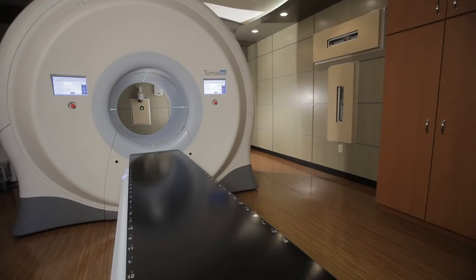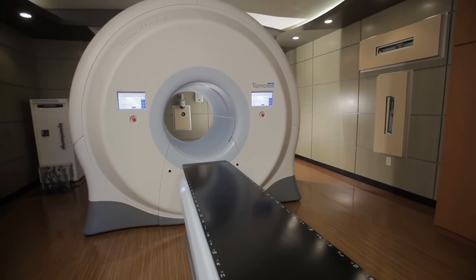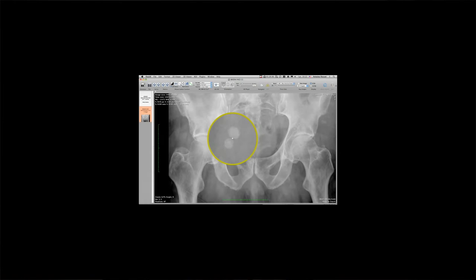One place that TomoTherapy shines is IMRT type plans where you have a larger tumor and you're maybe not sure exactly where the border is of that tumor. And this happens a lot where you're saying, well, I know it's in this region, I can see from the CT or MRI, this is generally the area, but I expect there's also some disease further out, right? So if I really want to treat this properly, I'm going to have to treat a much larger volume.